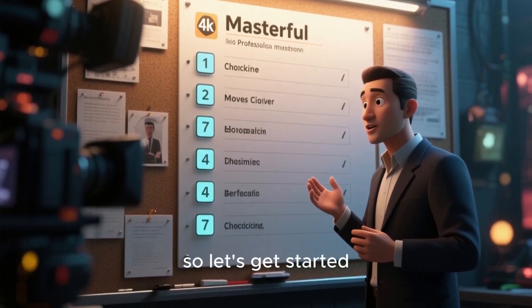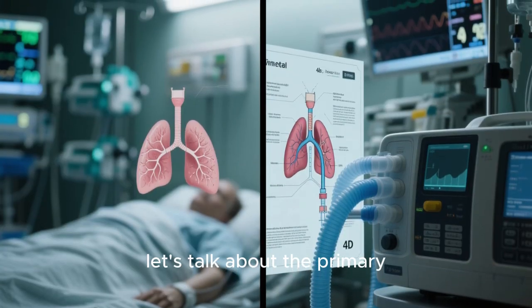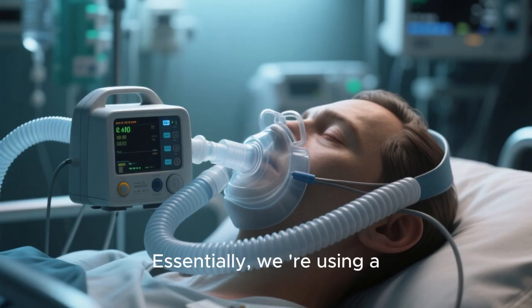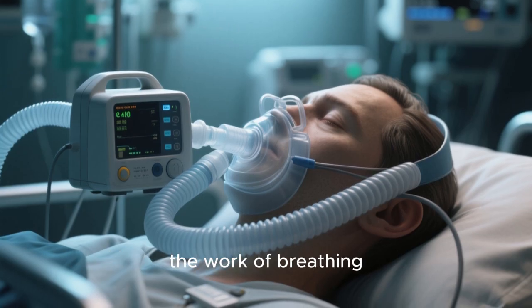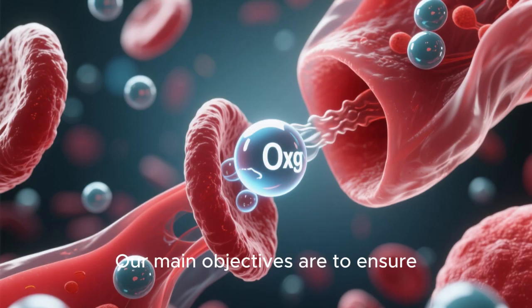So let's get started. First things first, let's talk about the primary goals of mechanical ventilation. Essentially, we're using a machine to support or completely take over the work of breathing for a patient who can't do it on their own.